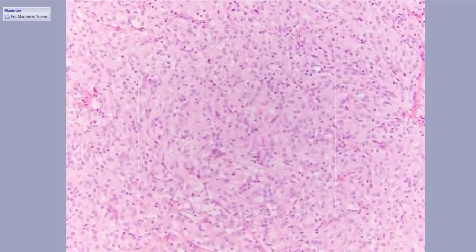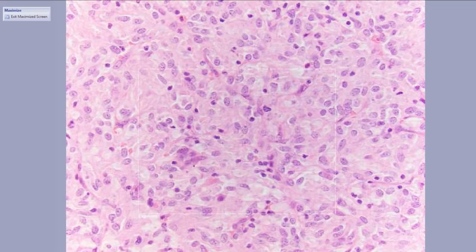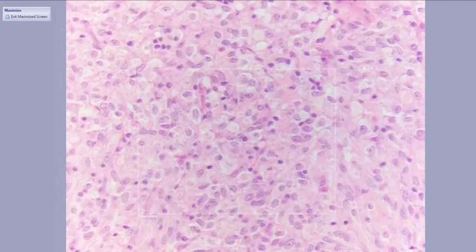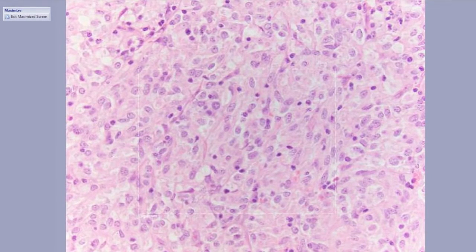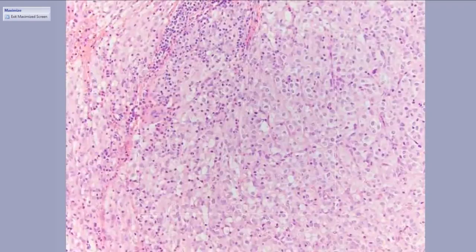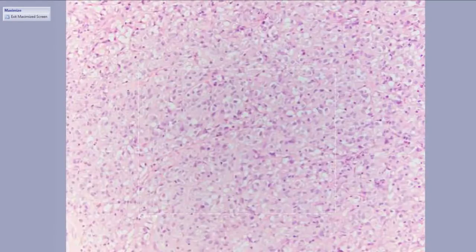All right, finally, we've escaped the stomach and we're moving farther down the bowels into the small intestine. Here we go, small intestine. Here's our mesenchymal mass. This looks very strikingly epithelioid, although there's not a lot of atypia. There's not prominent mitoses. Most of these funny-looking squiggles are lymphocytes. So this was a nice example of an epithelioid GIST. We're back on the GIST train, c-KIT and DOG1 positive. This is just to remind you that you always want to have GIST at the top of your differential. And this is a pretty classic epithelioid GIST.